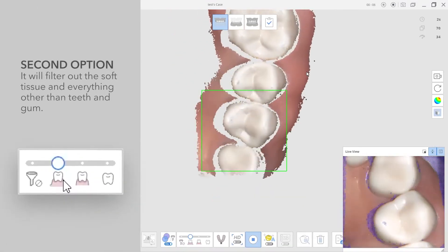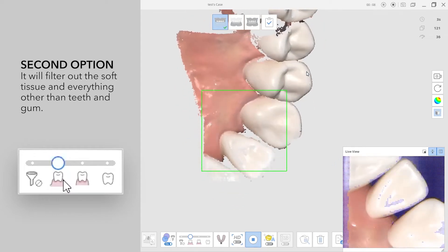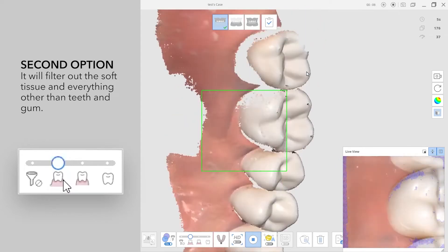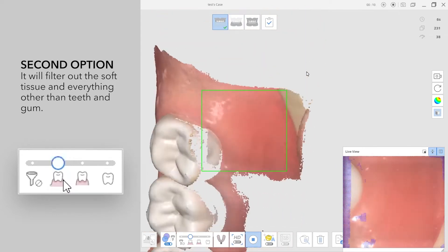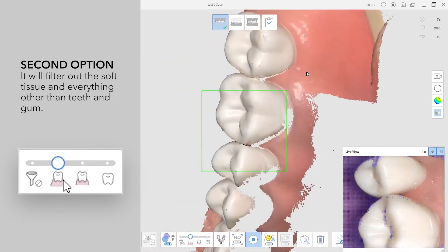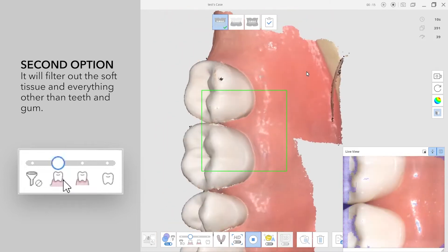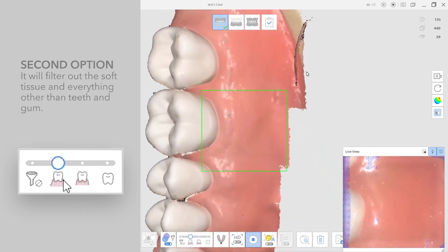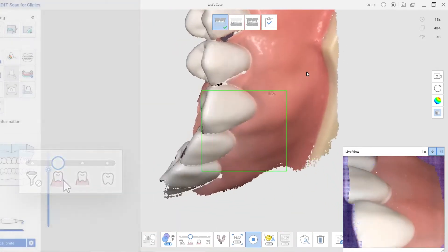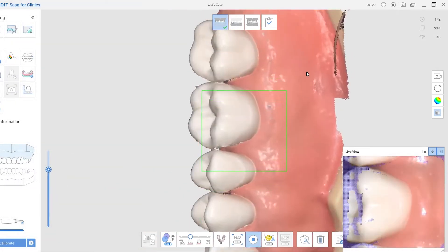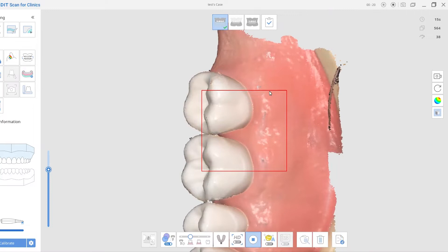The second option - the software will pick up certain amounts of gums and teeth, and it will filter out the soft tissues and everything other than teeth and gums. This is for general cases.